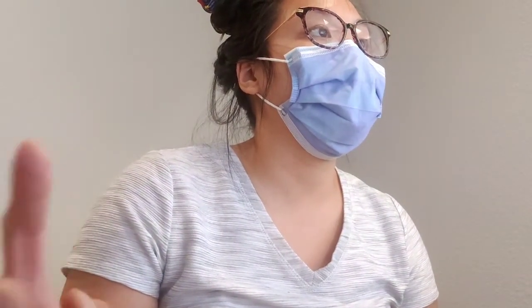The trigger threshold for pulmonary embolism CT exam is blank Hounsfield units. So they're just saying when you trigger for a PE study and you put your ROI there, your region of interest, so that it could do your scan time, it can calculate the Hounsfield as a contrast. It's supposed to be at 90 to 100 Hounsfield units.